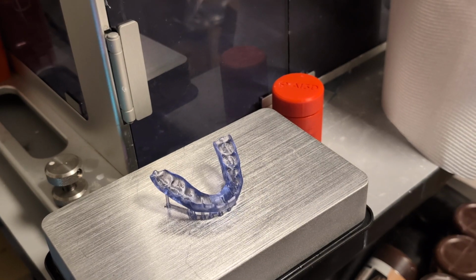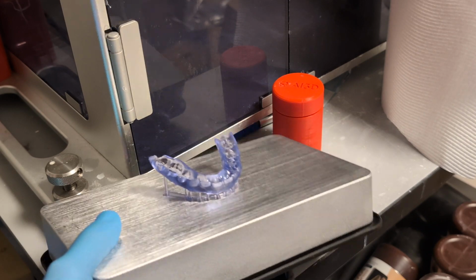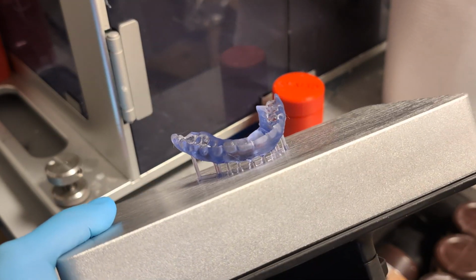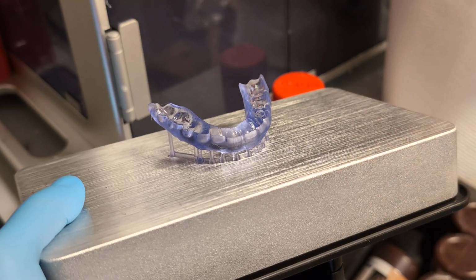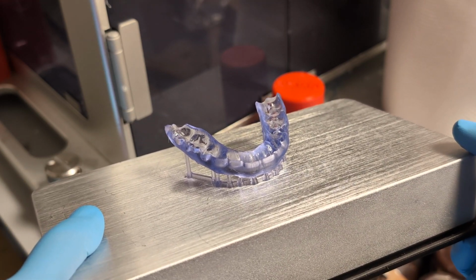Cool. So we got this splint here. This is actually my splint, printed with the new support settings. As you can see, very few supports that I need to cut off. I think there's about 12. So we're just going to go through and see how easy it is to remove these supports.